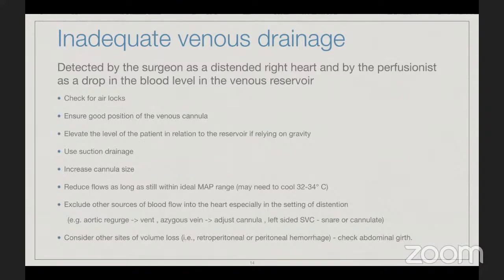Do you remove the bubble that is causing the airlock, or the air trapped there, by manipulating the cannula until it's in the reservoir, or are there other maneuvers? This is usually what is done. You can just chase the air upward and then toward the venous reservoir. And there's another maneuver. I read about it, but I've never seen it.